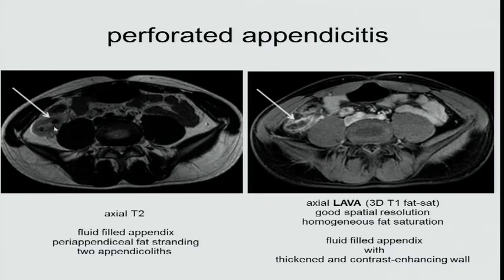Hunter. Well, what are the protons that are in, so there's calcification of fecal material. So what about the protons in bone? When you apply a signal to them, what do they do? Not a whole lot. Things that don't move a lot, bone cortex or calcification, are going to look black on MRI because they don't line up and then give you back a strong signal.